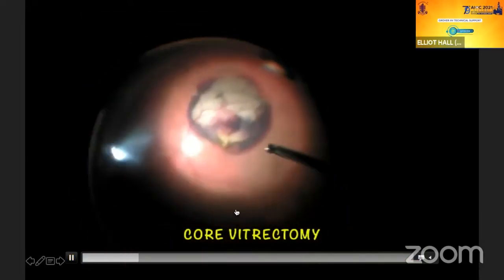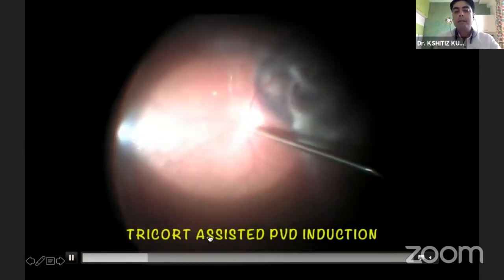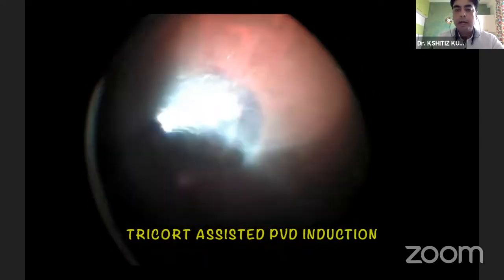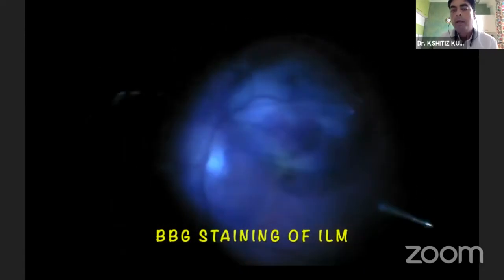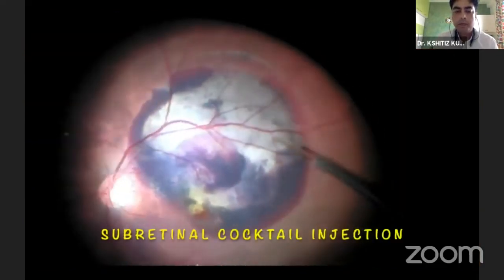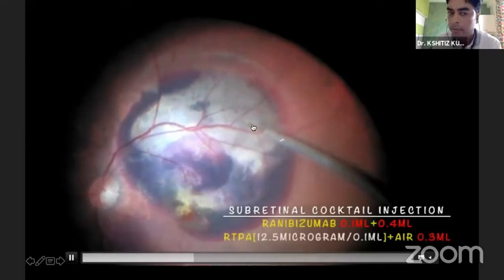So core vitrectomy was done, followed by TRICORT assisted PVD induction and completion of vitrectomy. This was followed by staining of the ILM, so that in case there's a blowout, particularly a foveal blowout, I would do an ILM peeling. Then the 41 gauge subretinal cannula was used. The site of injection I initially chose was in the area of the dehemoglobinized blood.